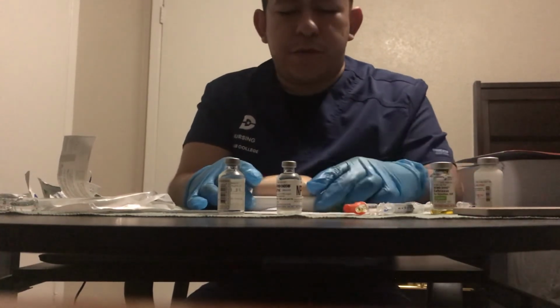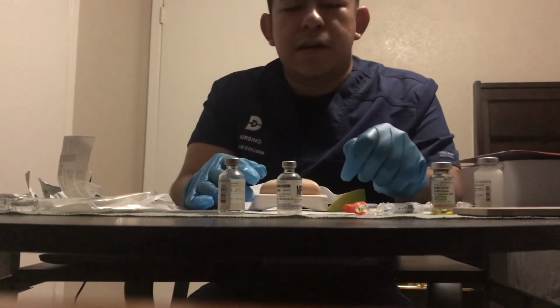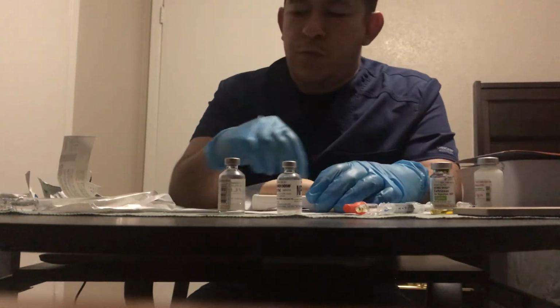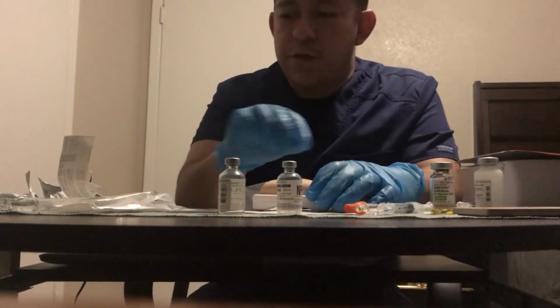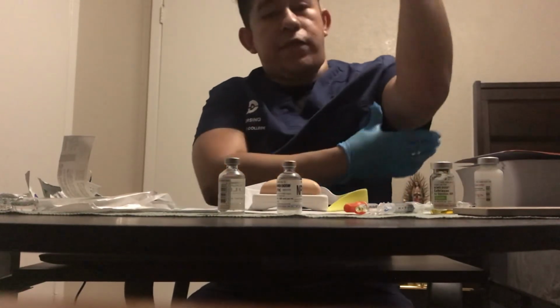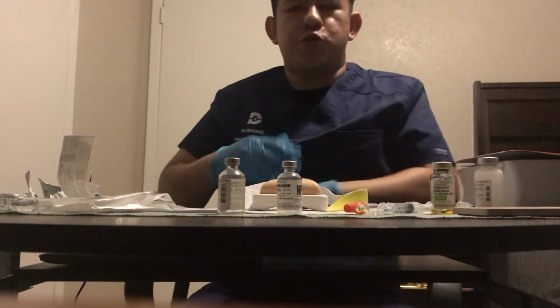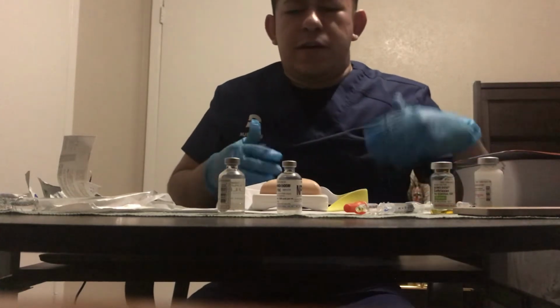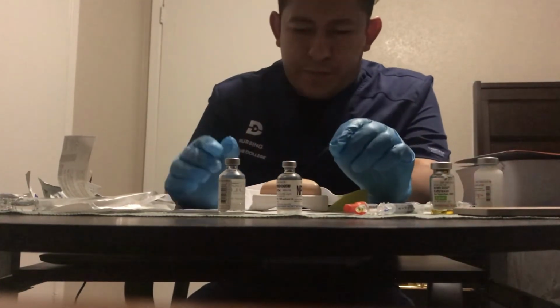TB or PPD. Now for the insulin, the insulin is sub-Q, and of course you wipe once again wherever the injection site is going to be. Wipe it with the alcohol pad, let it dry. That is given usually in the fatty parts, such as behind the arms or on the belly. Just make sure you rotate the sites so you don't cause any injury or bruising associated with multiple injections.